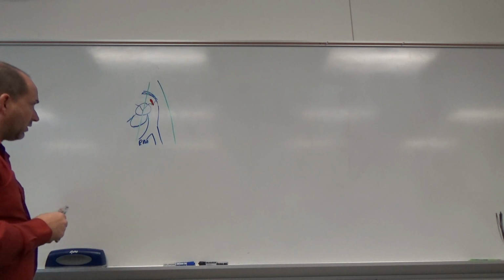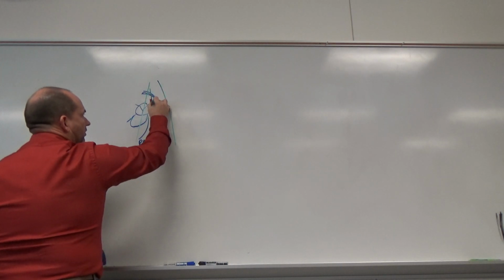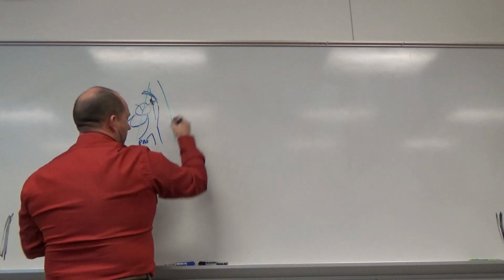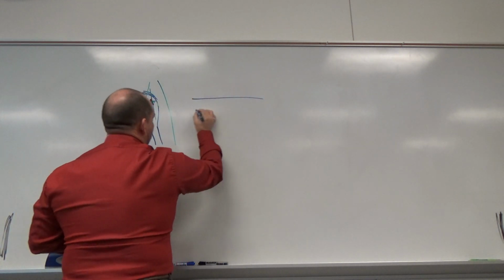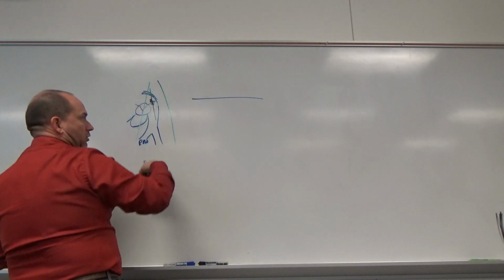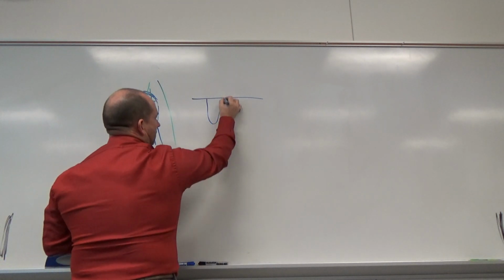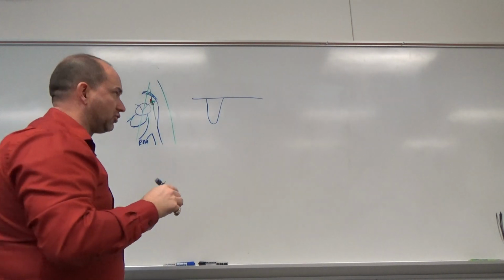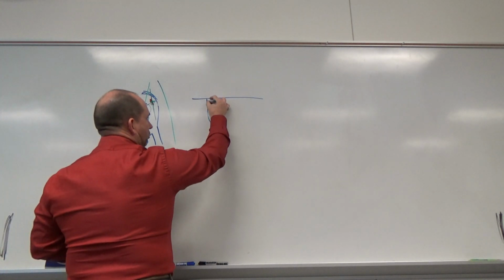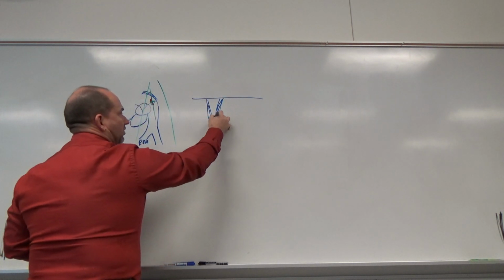This one again, we're going to sample with pulsed wave Doppler in the RVOT. And again, we're going to come up with a waveform that is below baseline because the flow should be going from the right ventricle out the pulmonary. It's going to look not quite as parabolic and rounded as the tricuspid jet is, but this should be enveloped because it's pulsed wave, it's range specific.